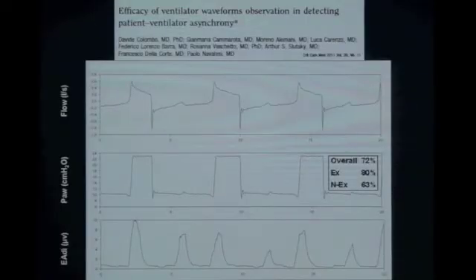Anyway, in this specific case, 72% of the physicians in my ICU recognize it, which concerns me a bit. 80% of the so-called experts, the physicians in staff, and 63% of the residents. Okay.